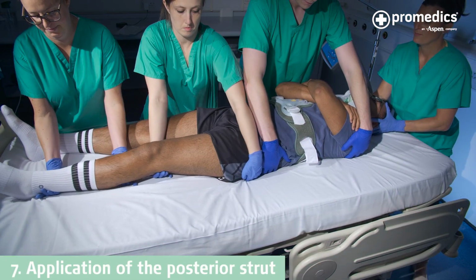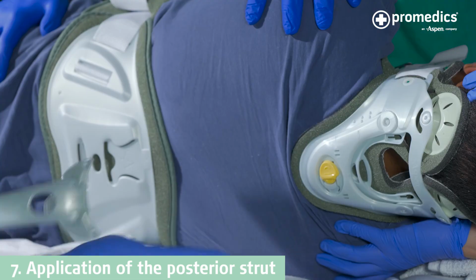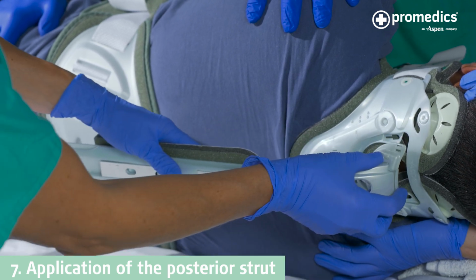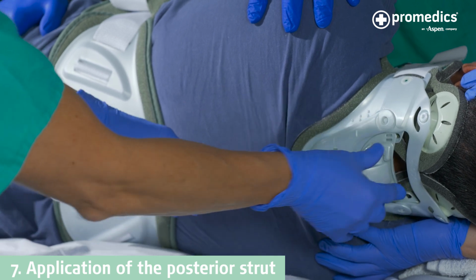To add the posterior strut to a CTO2, perform a 4-person log roll. The strut will align and fit into the 3 slots shown. Align the strut and pull down until this clicks and is locked in place.